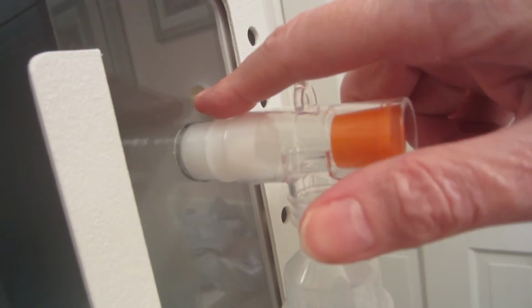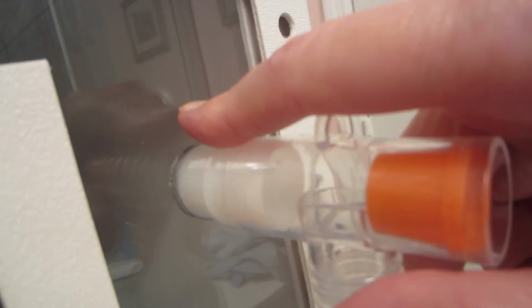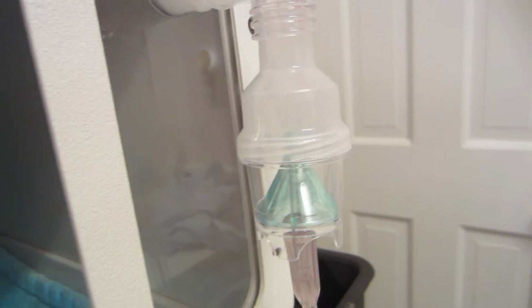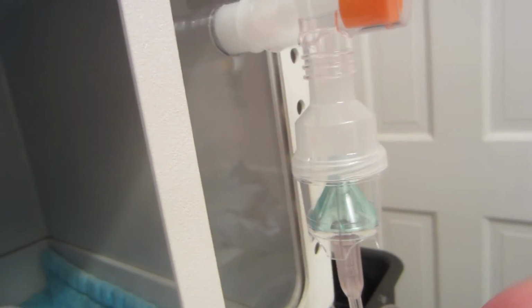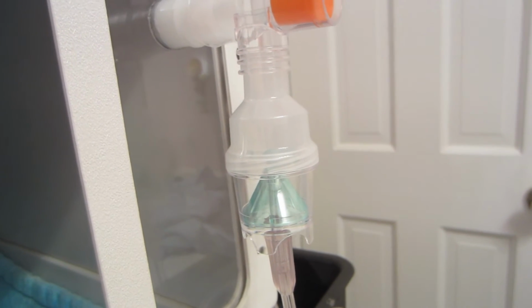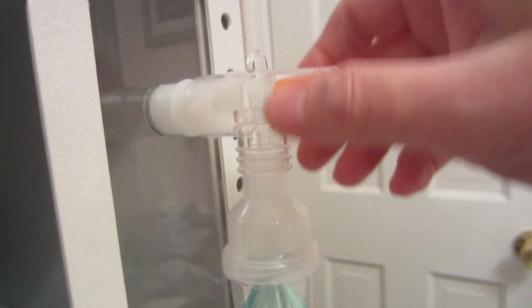And you will notice if you look inside the nebulizing chamber, you'll have a very fine mist coming out the end of the nebulizer up here on the top. That's how you know it's working properly. Keep an eye on it. I've had hoses fall off of the compressor, just all kinds of crazy things going on. So stick around pretty close so you can keep an eye on what's going on.